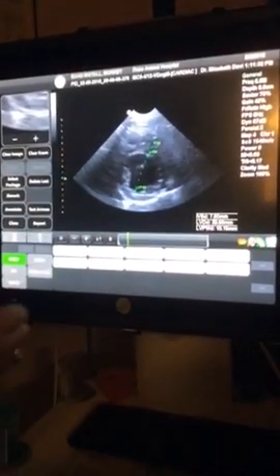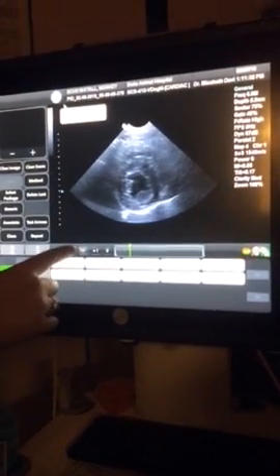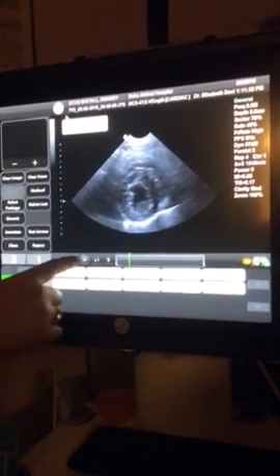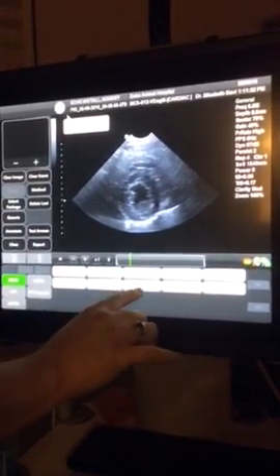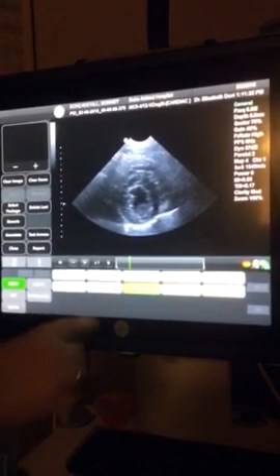Now we want to find systole, or we're going to close the heart, so we can use our scroll bar here just to make it a little faster, and then you can use the plus or minus sign to close it before it starts opening again. Okay, now we're going to use the bottom row, which is systole. So we want to activate our first measurement.